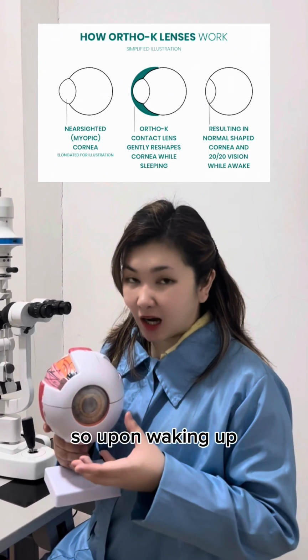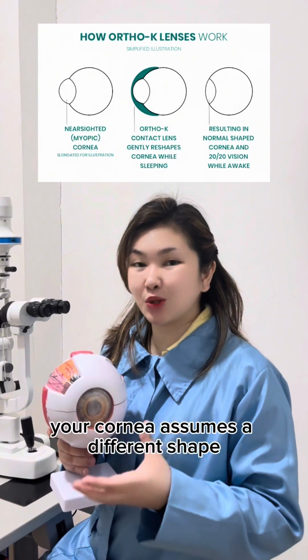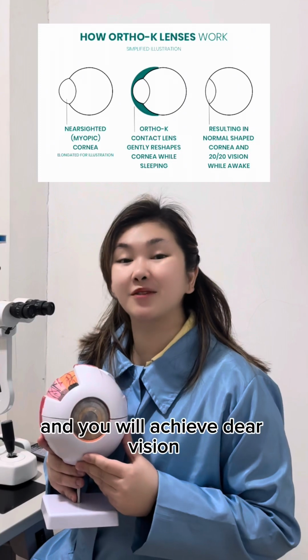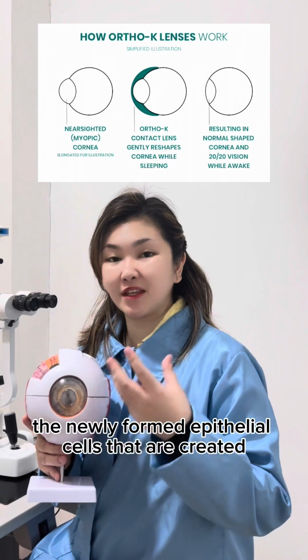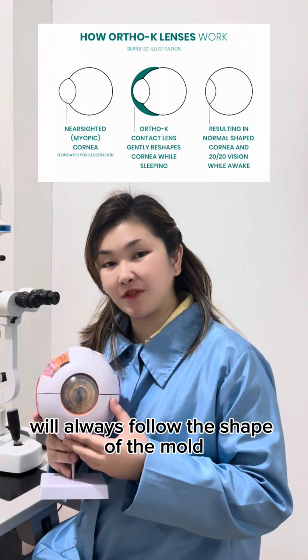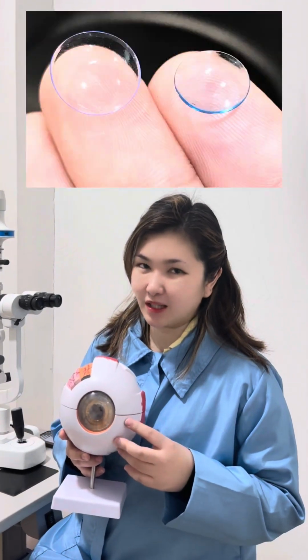So upon waking up, when the molds are removed, your cornea assumes a different shape and you will achieve clear vision. As long as you wear the molds regularly, the newly formed epithelial cells that are created will always follow the shape of that mold and you will always have clear vision.